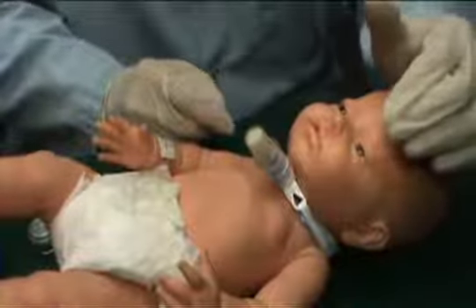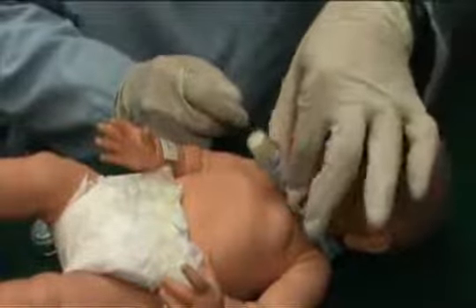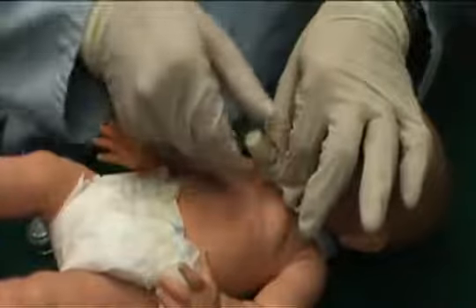To remove any accessory, you must again ensure that you're wearing non-sterile gloves. While firmly holding the base of the connector with one hand, use your other hand to gently rotate the HME while pulling up, which loosens the seal.